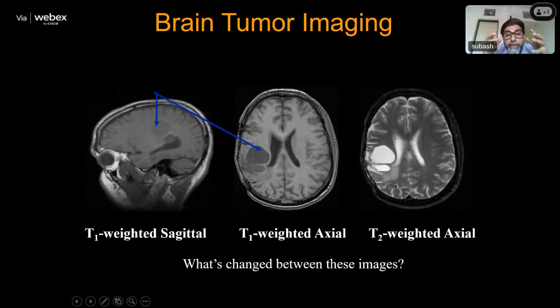So when you are doing clinical imaging or diagnostic imaging, the two sets of images, T1 weighted and T2 weighted, what they mean we will discuss a little later. But these are the two minimum sets of images which are required to diagnose a patient. And this T1 image gives you anatomical details. You can see the distinction between gray matter and white matter is very well visualized here.